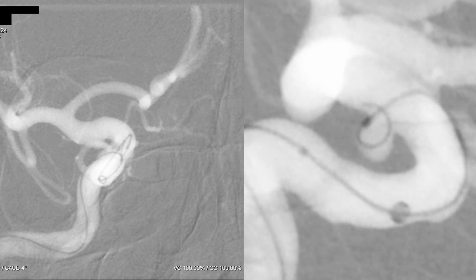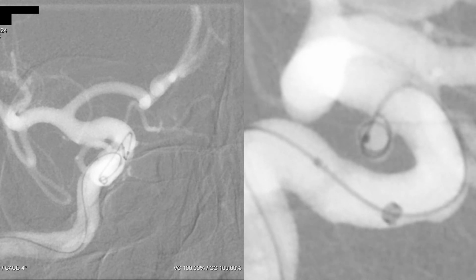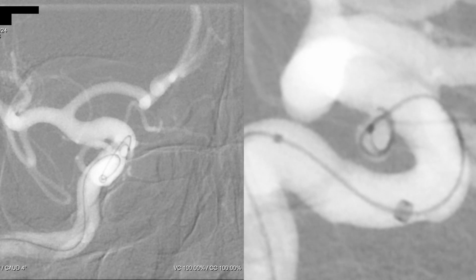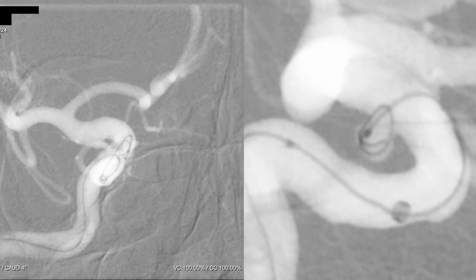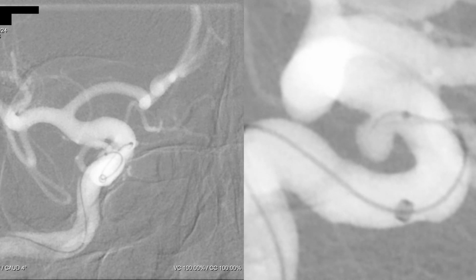We're trying to build the basket. And now, as you can see, the coil is a little bit bigger than the aneurysm. We will try it a little bit, and if we see that it won't work, we can remove this coil and take a slightly smaller one.